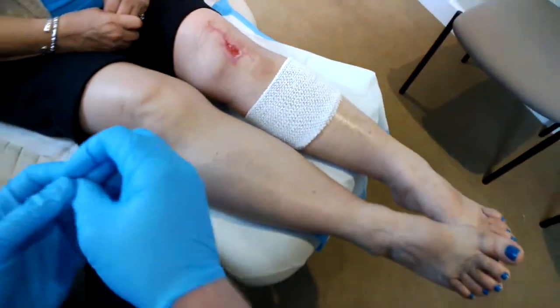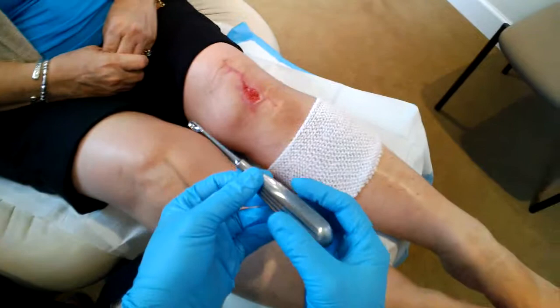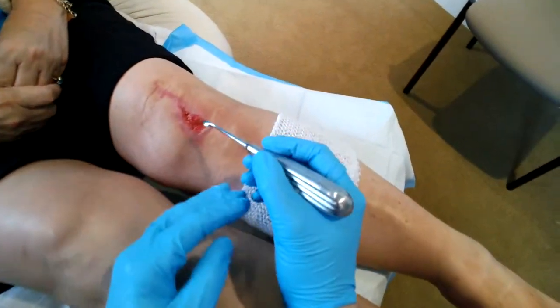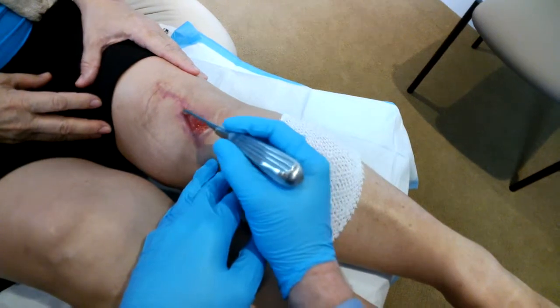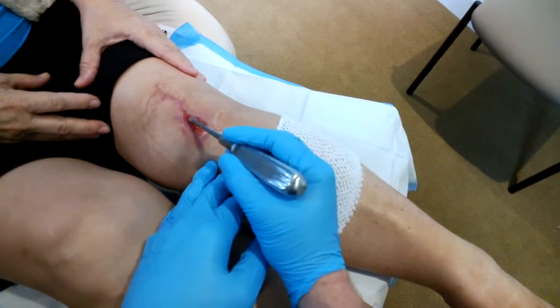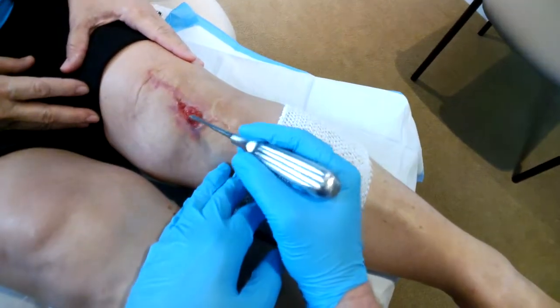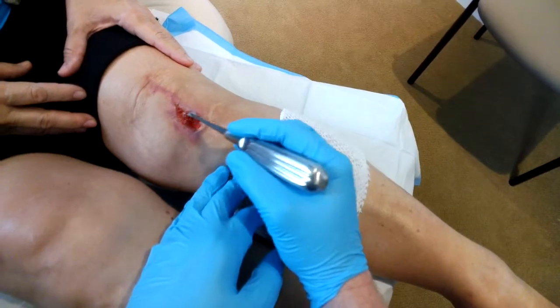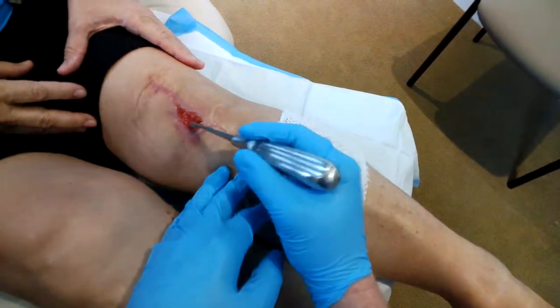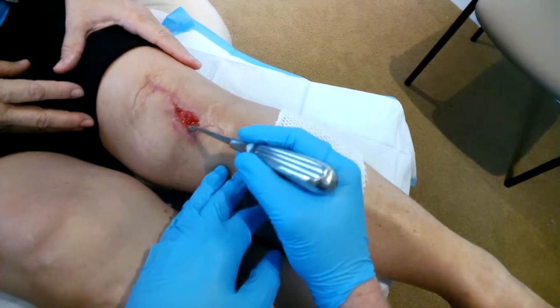The first thing we'll do is the debridement. I'm going to use a curette and just gently scrape the wound, ever so gently. That's going to remove some of the bacterial debris and some of the fibrinous material that's there. It might cause just a tiny bit of bleeding, and this is going to help clean the wound and prepare it for our wound vac, which is a sponge connected to a negative pressure device.